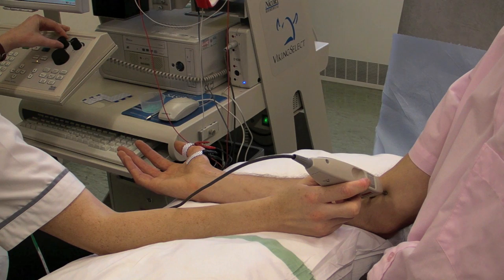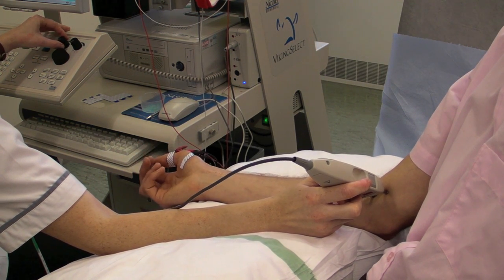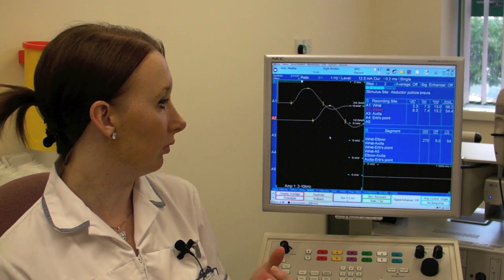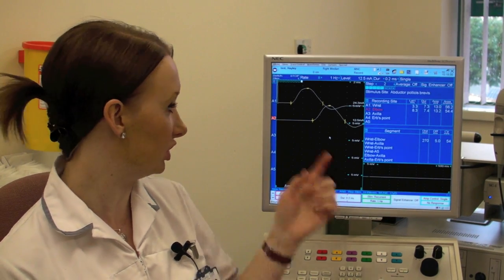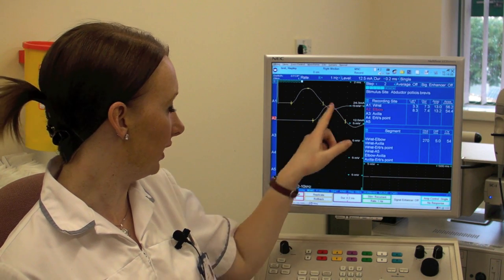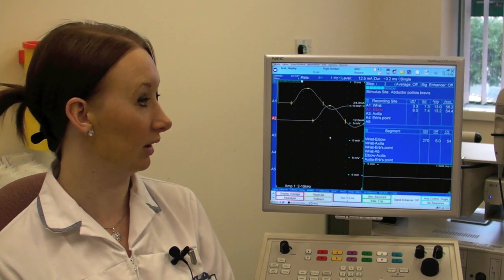We use the stimulator to stimulate the nerve at certain points along the nerve pathway and we record that nerve response, which you can see here on the screen. We record that using electrodes — sticky tab electrodes — which pick up the waveform which you can see on the screen here. From that we can work out the onset of the waveform, the speed that the nerve is travelling, and we can measure the distances of the nerve as well.